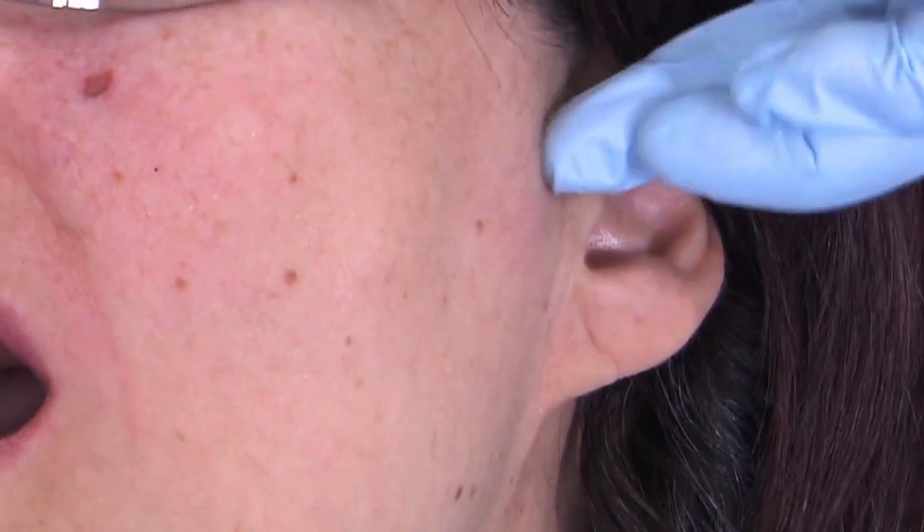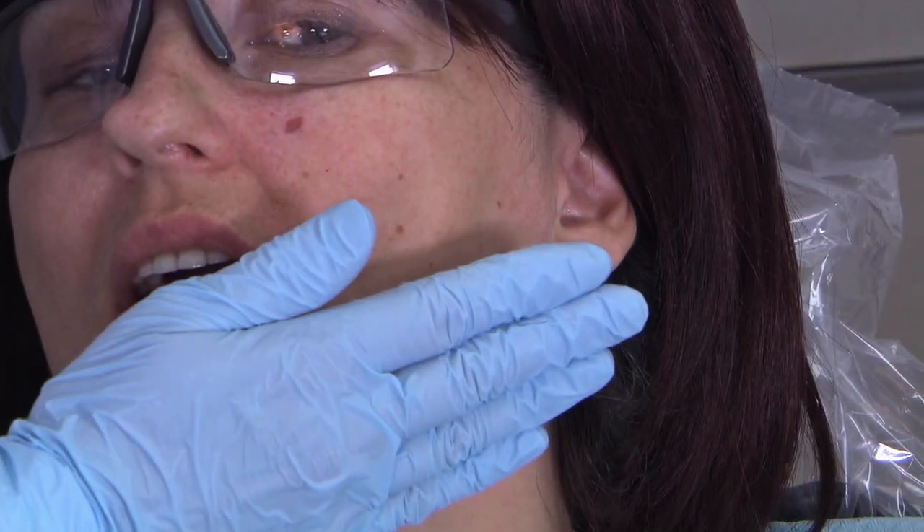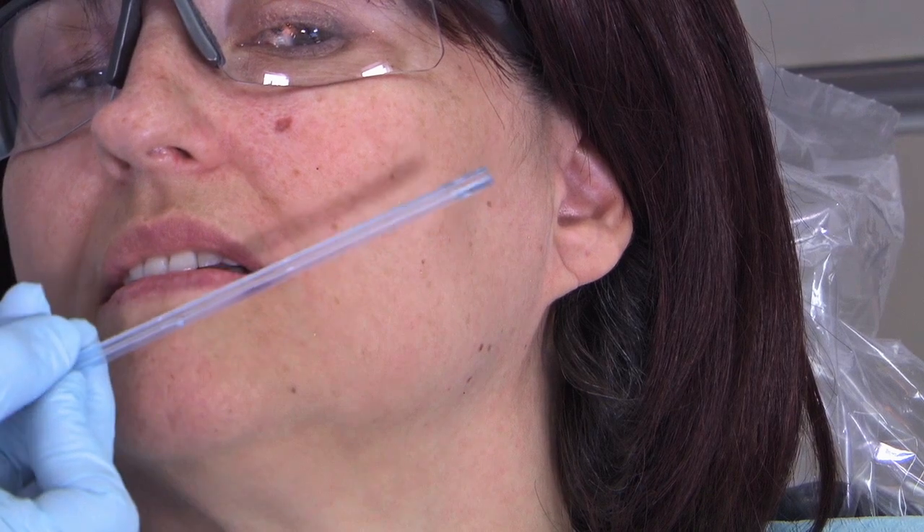The other thing that's sometimes used to our advantage is the flare of her tragus right here. Hers is fairly smooth — it just flares out just a little bit. But if someone has quite a bit of flare out, that can relate to how far out their ramus flares. So if they have a very narrow chin, the tragus may be tucked in. That's going to help me decide how far over in relationship to the bicuspids I'm going to be. If there's really wide flare, I might be back closer to the molar; if they have a narrower profile, I may be a little closer to the bicuspid.